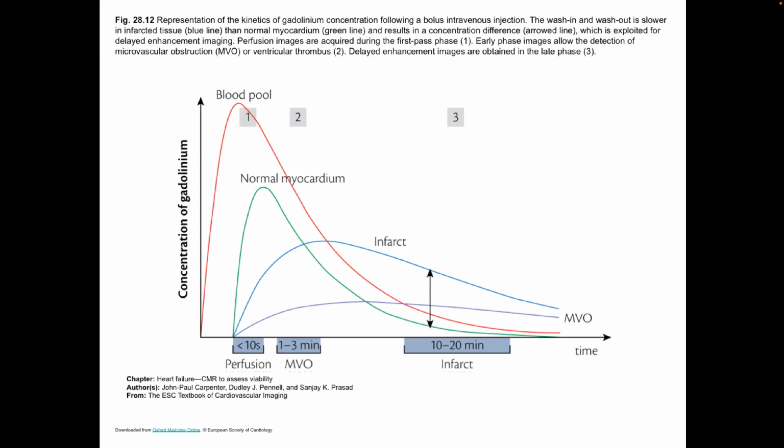The limitation is we got to hang around for 15 minutes. This scanner is costing us $800 an hour, right, to run, and I got to sit here for 15 minutes. Okay. The opportunity is, oh, look, I got 15 minutes. I can do a whole bunch of imaging of this patient in that 15 minutes, but it has to be something compatible with having just injected contrast.